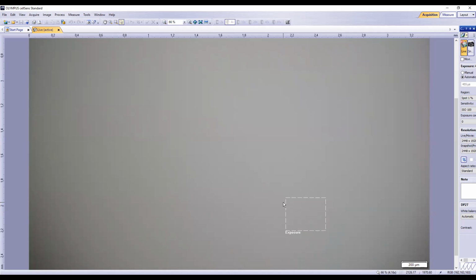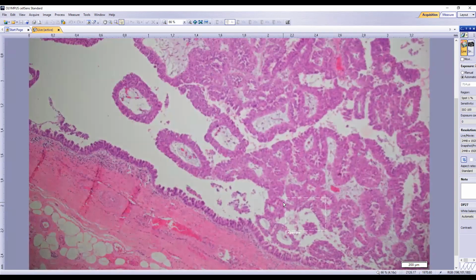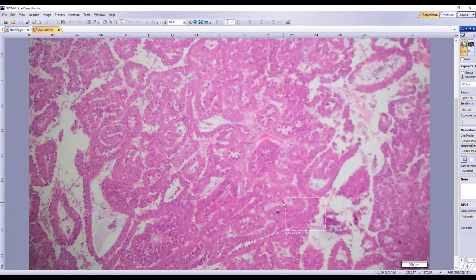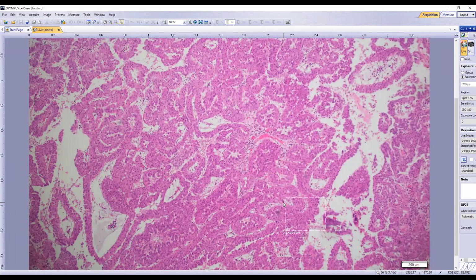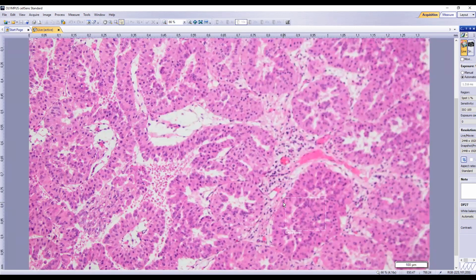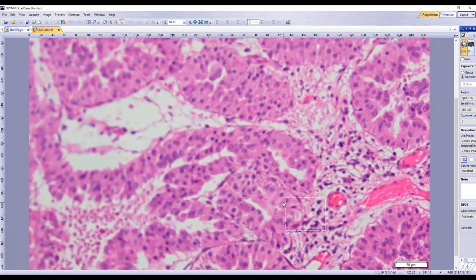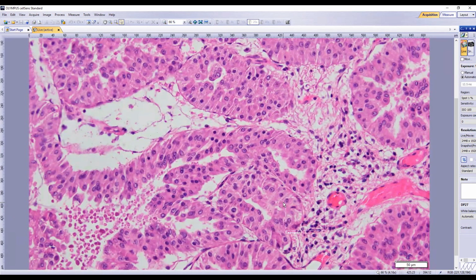This one is a 65-year-old male with a 7-centimeter cystic lesion in the head of the pancreas, presenting with jaundice and weight loss. Is that the oncocytic variant of the IPMN? What do you call it? This intraductal oncocytic papillary neoplasm, right? It is. Wow. I don't need to teach you guys anything. You guys know it all.